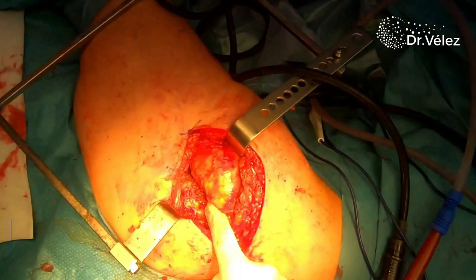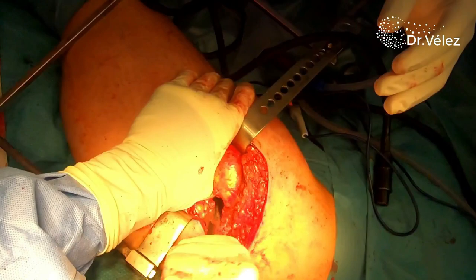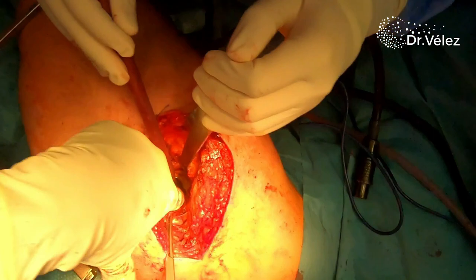So after preparing the femoral canal, we're now going to trial the femoral head. So we place a Hohmann retractor in the anterior aspect of the acetabulum, exposing the acetabulum. We then remove the remaining round ligament from the acetabulum. And then with a 47 millimeter trial head, we check for correct fit and stability.